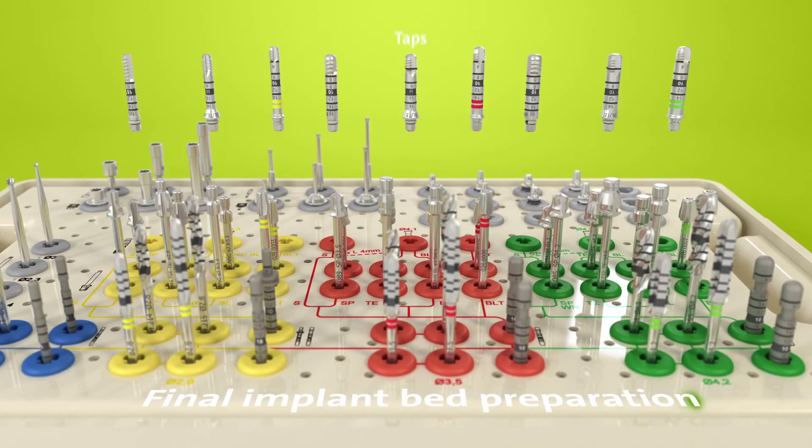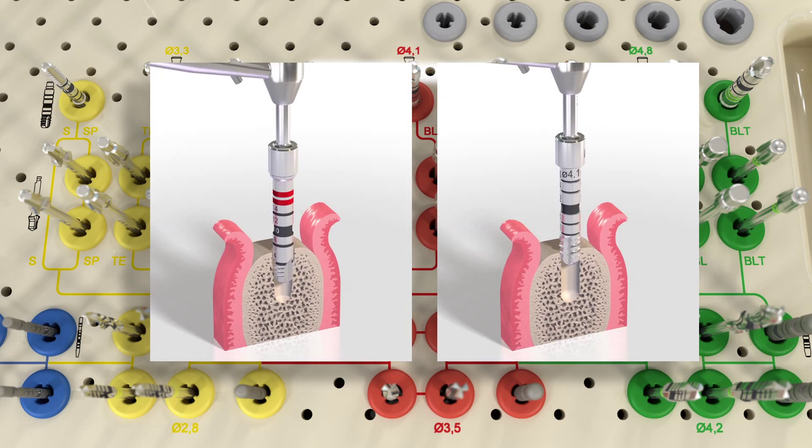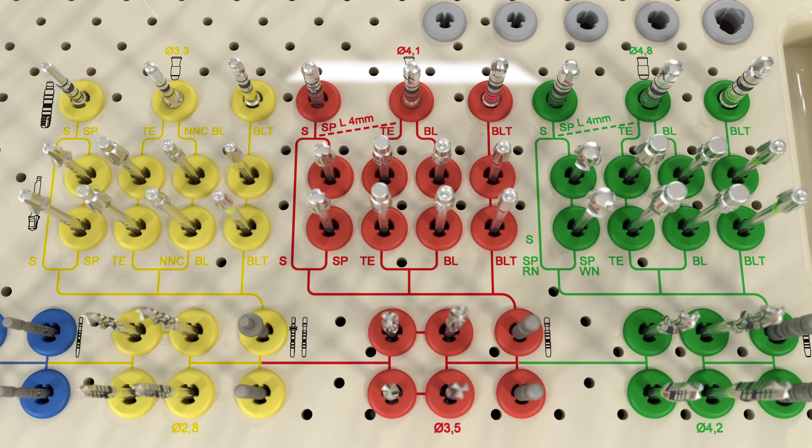The workflow lines further lead from profile drills to taps, the instruments used for the final implant bed preparation. Tapping prepares the implant bed for a specific thread type. It's an optional step that provides flexibility to adjust the surgical protocol to the bone class to help achieve optimal primary stability. Tapping is recommended in dense bone with large diameter implants.